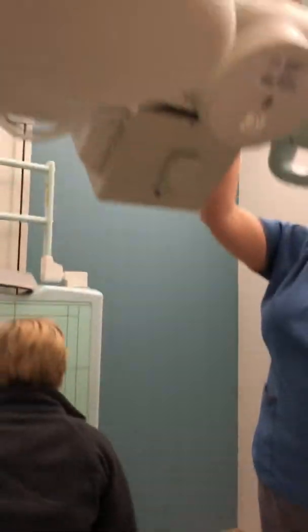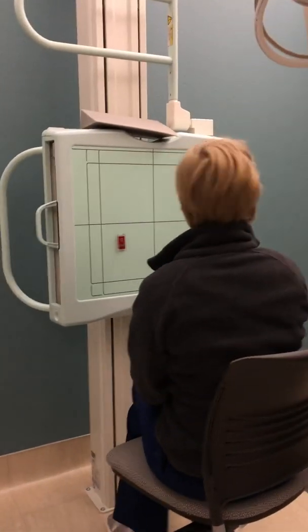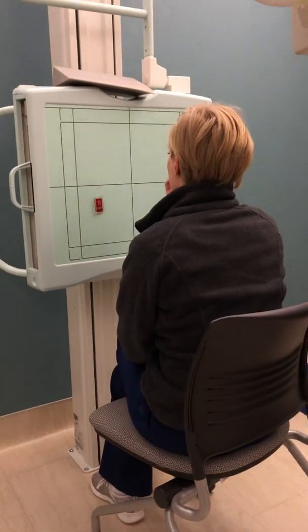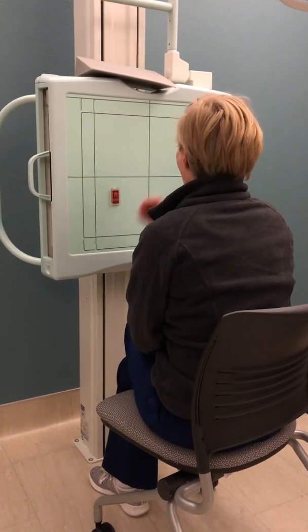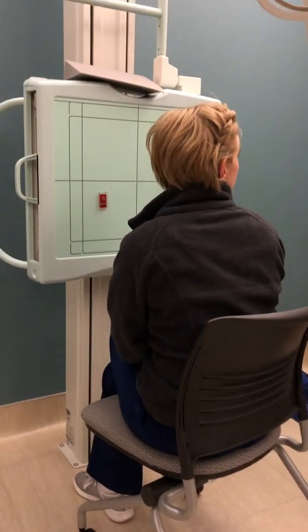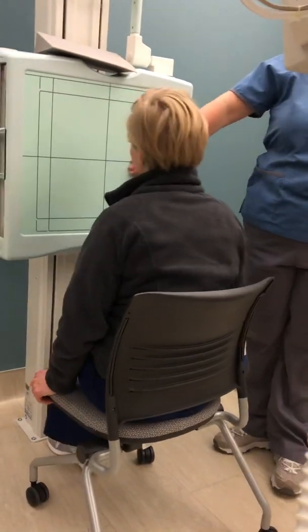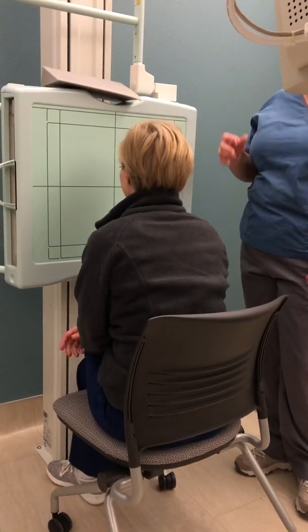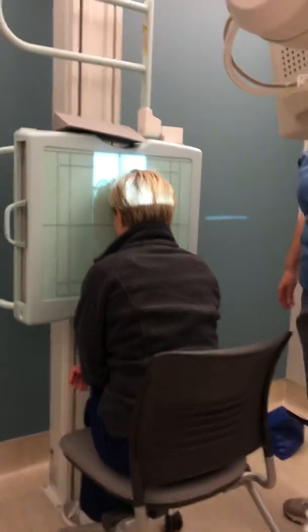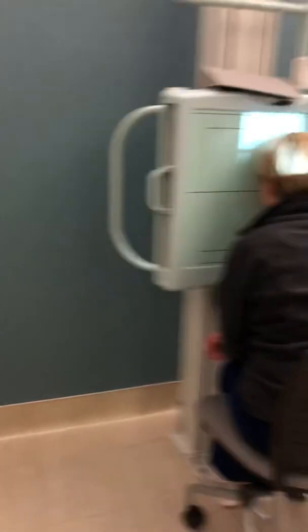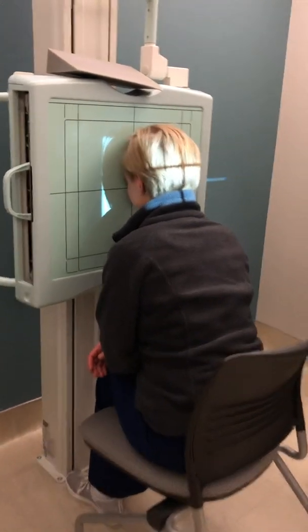I'm going to reduce my angle to 15 degrees because we're going to do the Caldwell. So this is where you switch your marker because now that she's PA, her right side is over here. Put your nose and forehead against it. Caldwell is 15 degrees caudal, and we're going to be exiting through the nasion, which is where the bridge of your glasses would be.